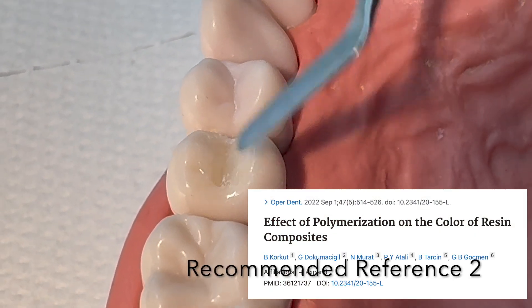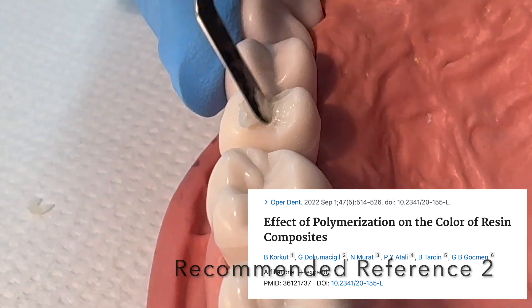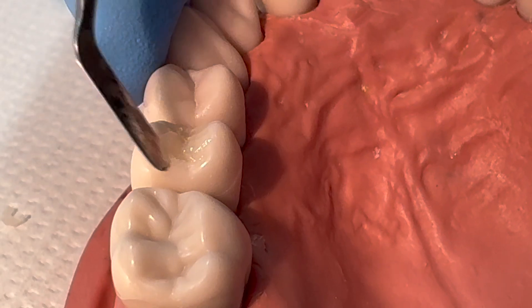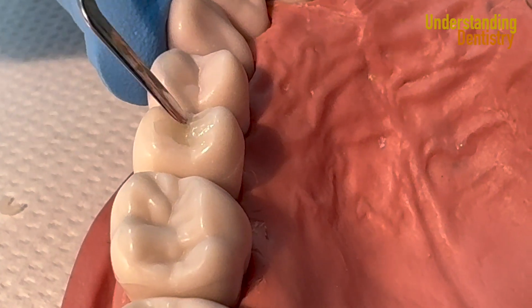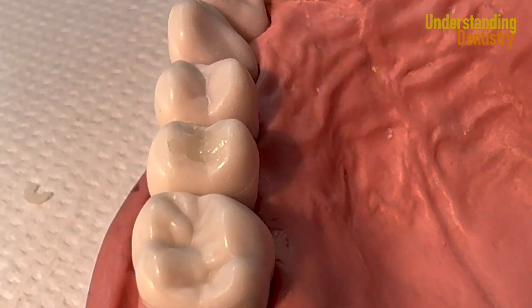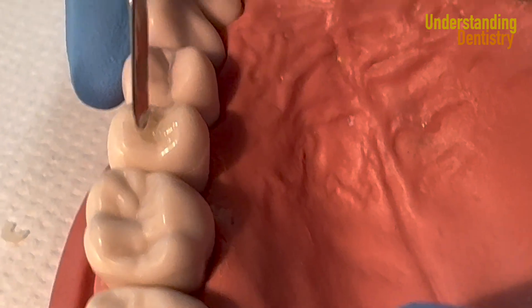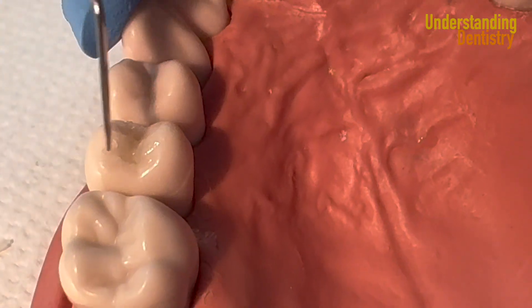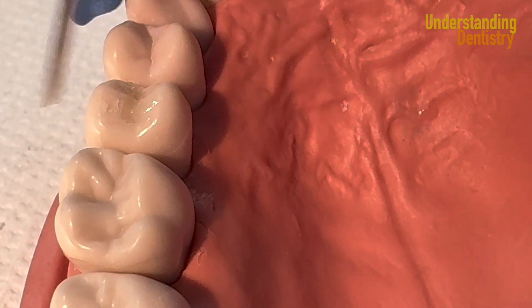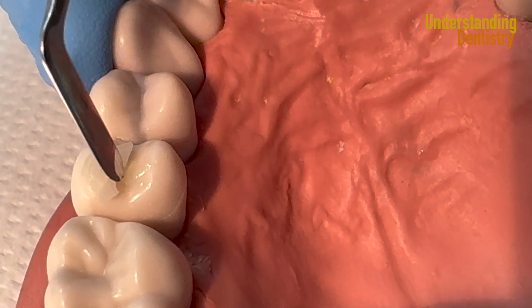Keep in mind that as you light cure, every brand of resin will change color a little bit, so you should light cure even in the trial phase to make sure the color will be nice. In some cases this will be required. Here we have a plastic tooth, so even though this resin adapts to the tooth color, this is just a tutorial.